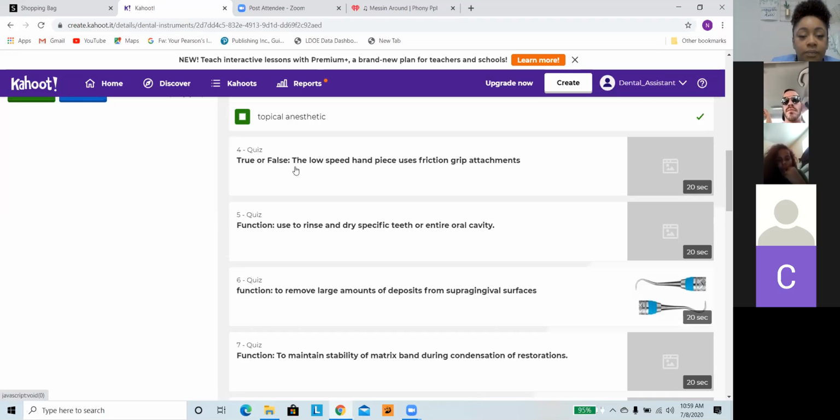It's a mechanical handpiece. So my question is, can you use a low-speed handpiece to cut like you can use a high-speed handpiece? No. Your low-speed handpiece will cut to a certain extent, but it's more like a fingernail file where it can give you a little shape, but it wouldn't cut through a decay or cut a tooth down.